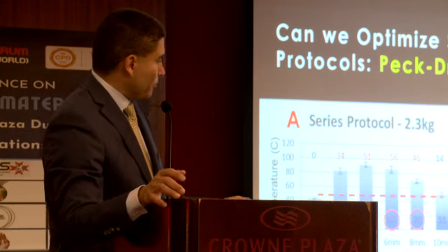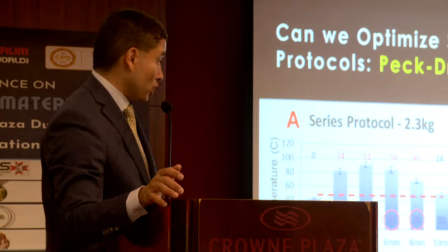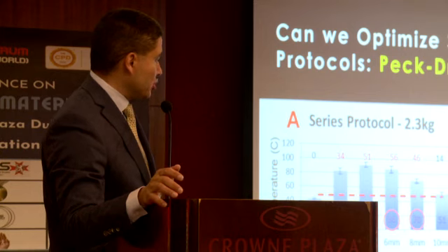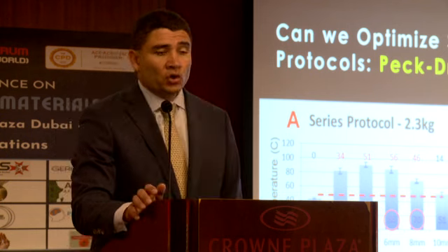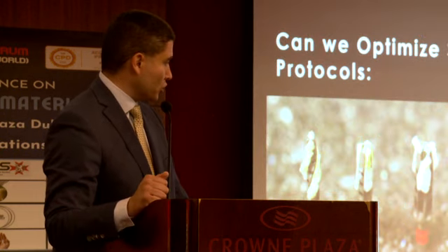Well, the drill pecking protocol, as you can see in the green area of the bar charts here, also produced not as much heat perhaps as the traditional protocol or the 1500 RPM protocol in the red bar charts, at different implant depths, with heat generation on the vertical axis. You can see that even the drill peck protocol in green also yields higher temperatures, right? So the drill peck protocol is not helping you.